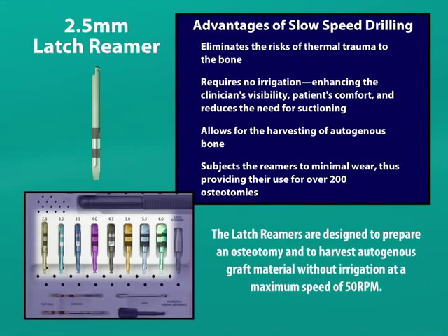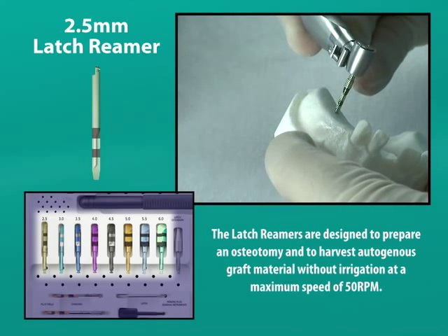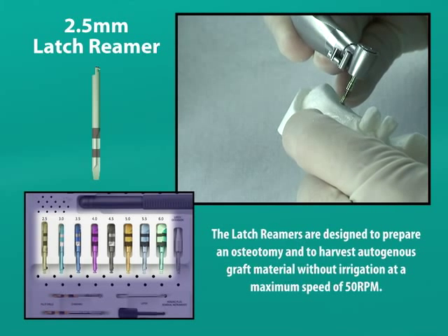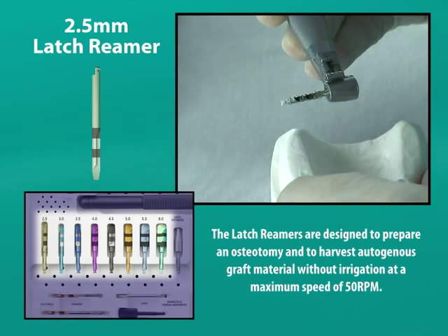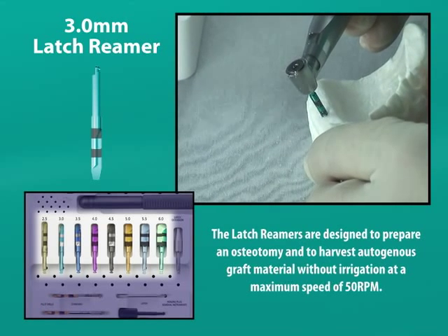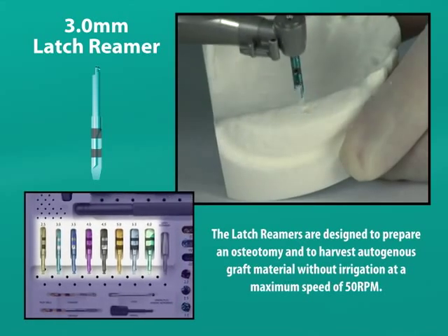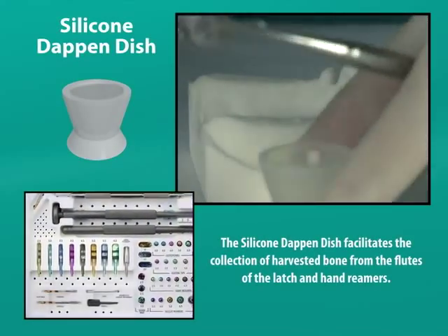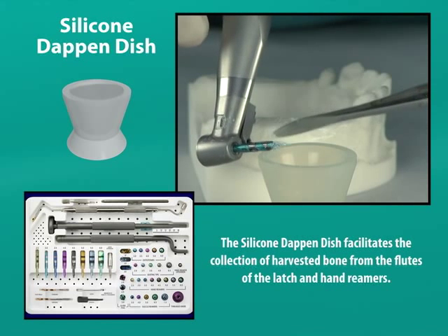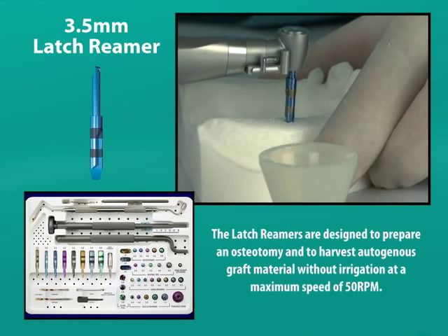Each titanium reamer is color coded and numerically marked according to its diameter. We will initiate our widening of the pilot osteotomy with a 2.5 millimeter latch reamer. Since we will be placing a 5 by 6 millimeter implant, we will be incrementally reaming with 6 reamers from an initial width of 2.5 to a final width of 5 millimeters, to match the diameter of the intended implant, and to a depth of 8 millimeters, which will position the implant 2 millimeters below the bony crest. We will now continue widening the osteotomy by half millimeter increments until the final width of 5 millimeters is reached and a depth of 8 millimeters is achieved.